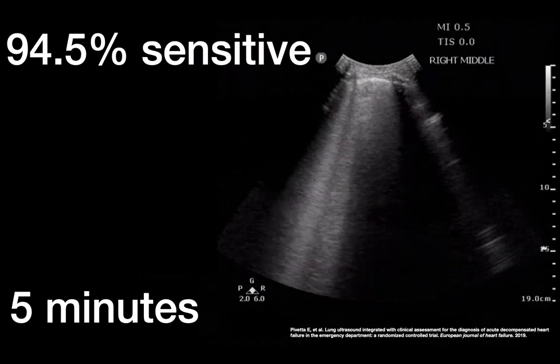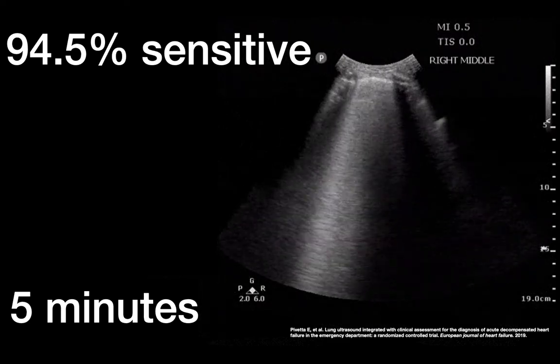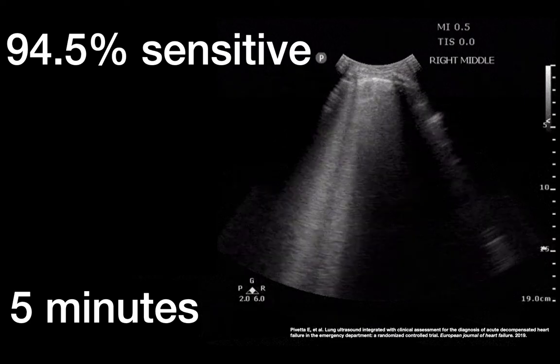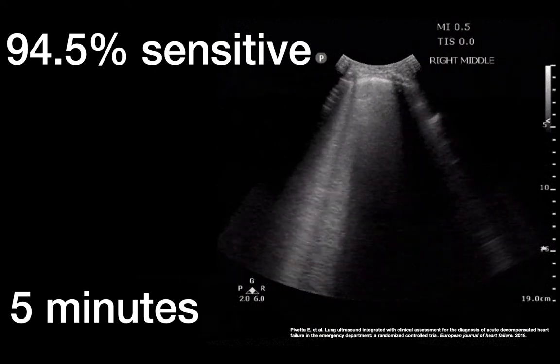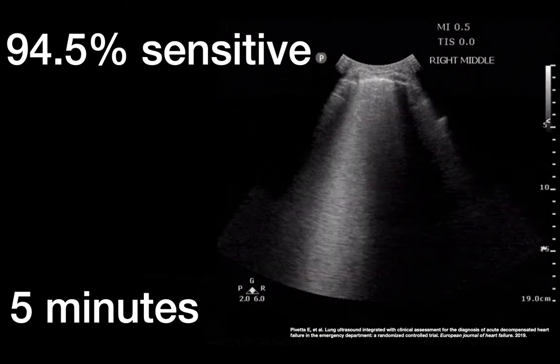This study came out in 2019, comparing ultrasound use to standard chest x-ray plus pro-BNP. It found that the use of lung ultrasound was 94.5% sensitive in screening patients for heart failure and could also be done in under 5 minutes, compared to 2 hours in patients who had x-rays plus BNPs done.